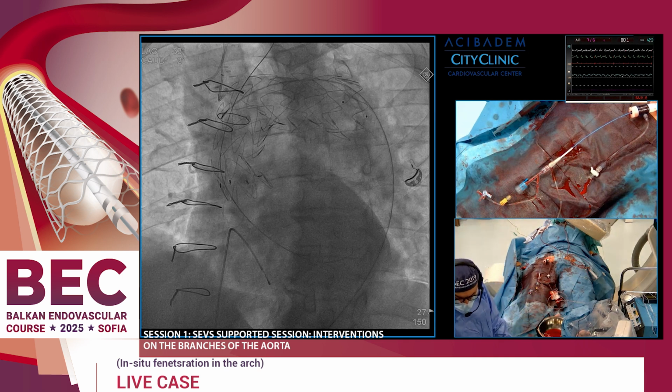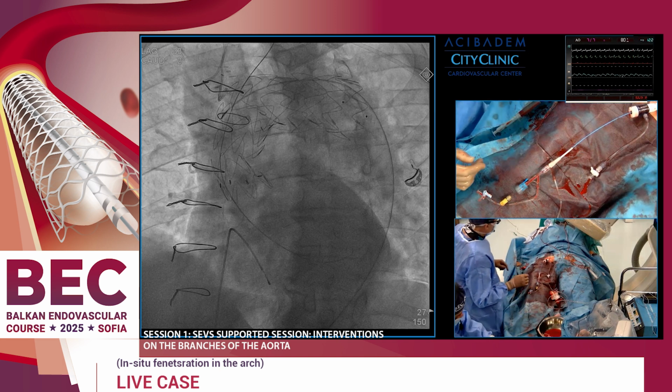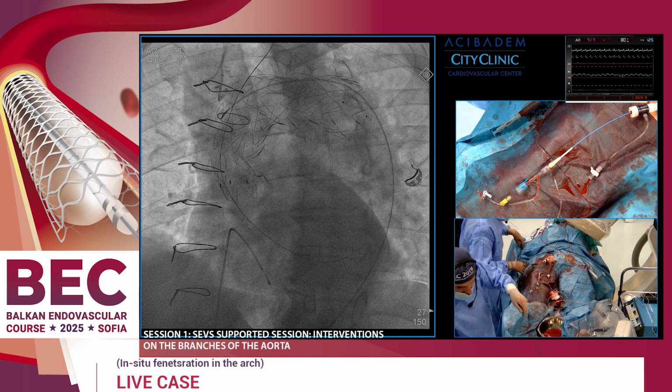Do we have the Astato? Yes, this is an Astato. Okay, we have an Astato, one of the most aggressive wires for peripheral intervention, with an aggressive non-hydrophilic metallic tip. The accent is on metallic, so the tip has to be metallic in order to provide penetration.